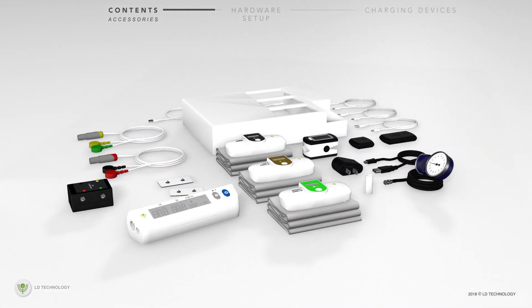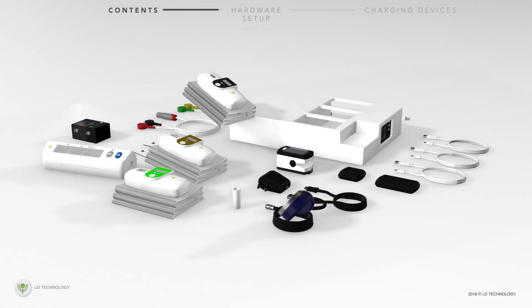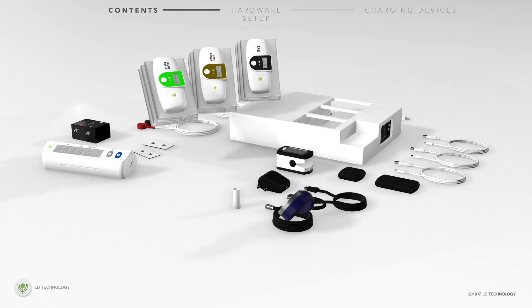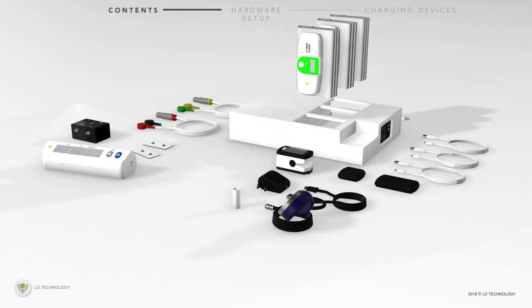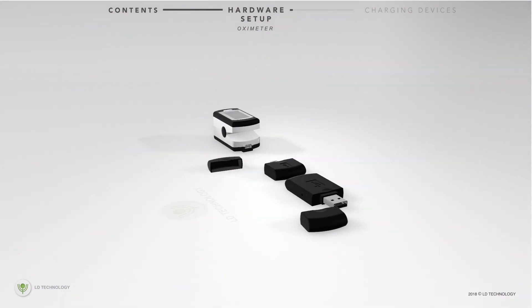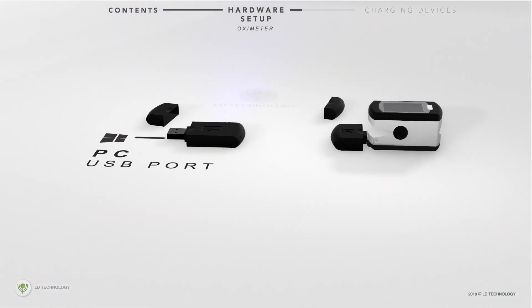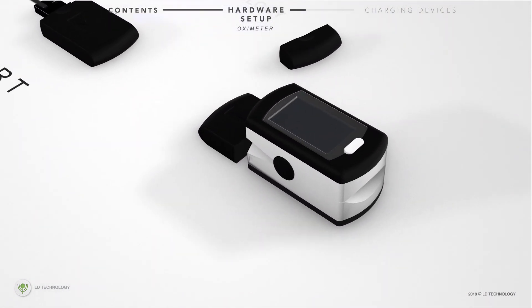The setup of the hardware involves the following process. First, place each of the Bluetooth cuffs upright with their USB connection exposed into the open slots of the console box. Next, connect the pulse oximeter to the small black USB key, and then connect the larger black USB key to the PC's USB port.